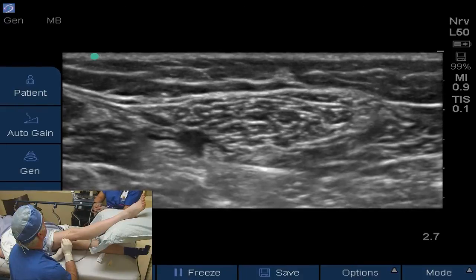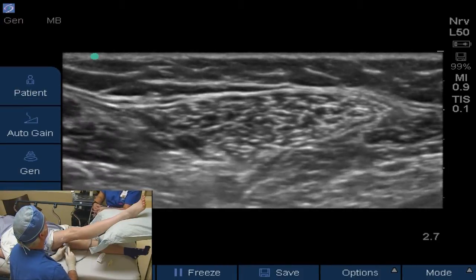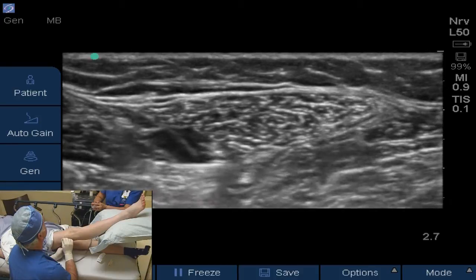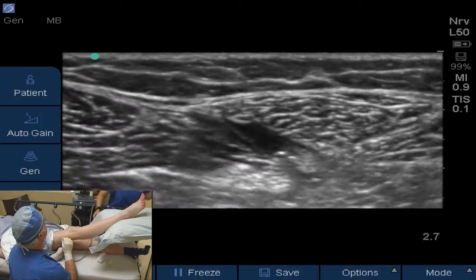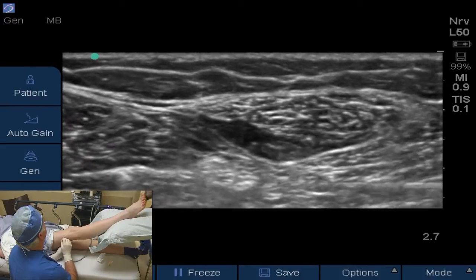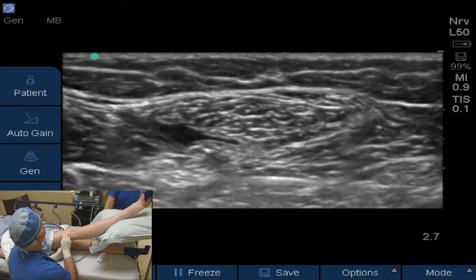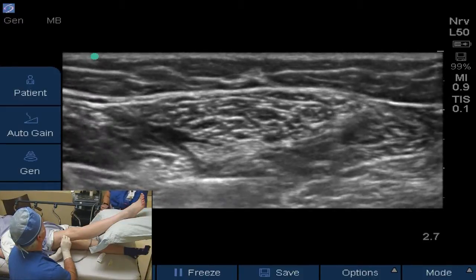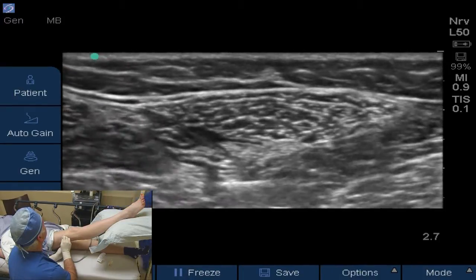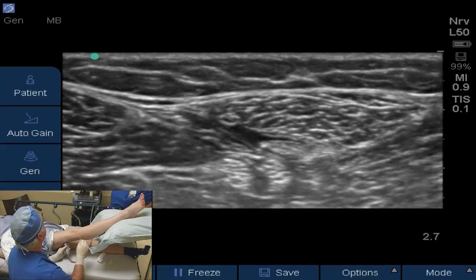Give me a couple right there. Put some more local in here as we proceed. At the end here, I've got the needle between the two nerves inside the sheath, between the tibial and peroneal nerves, and split them up just a little bit with our last five cc's. We'll pull back our needle and finish our block.